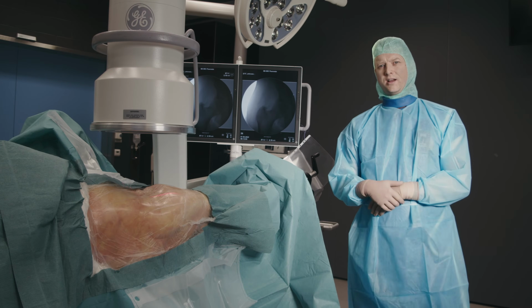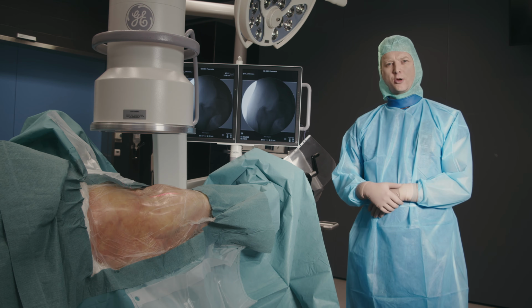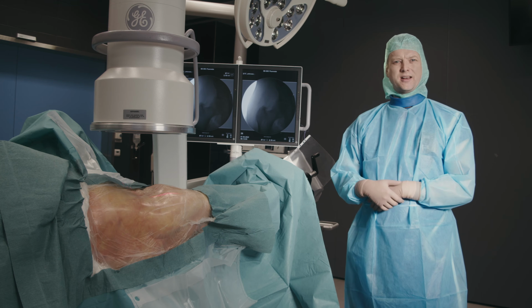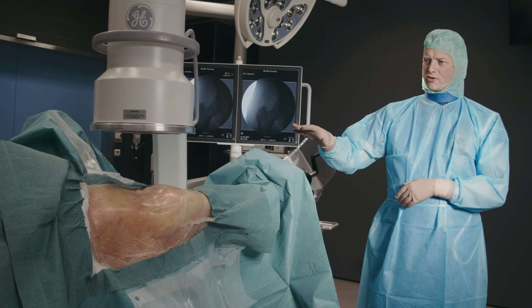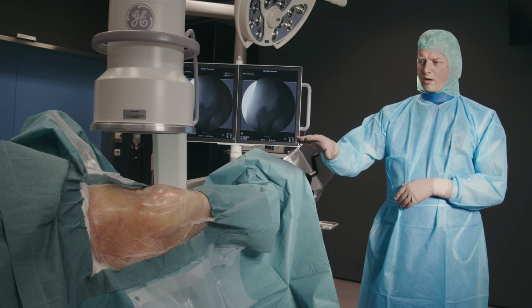Let's get started. The patient has an intertrochanteric fracture of the proximal femur to be treated using a cephalomedullary nail. The operation is usually performed under spinal anesthesia, but general anesthesia can also be used. The patient is supine on a traction table like this.